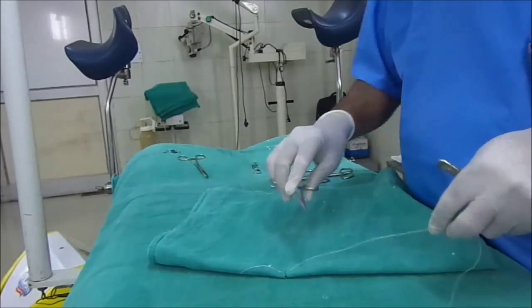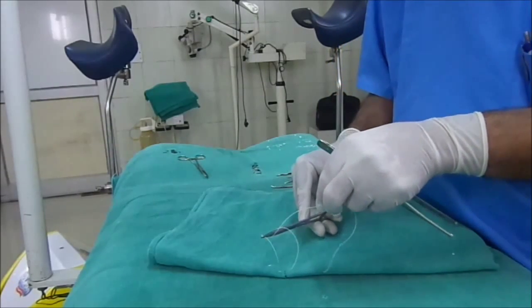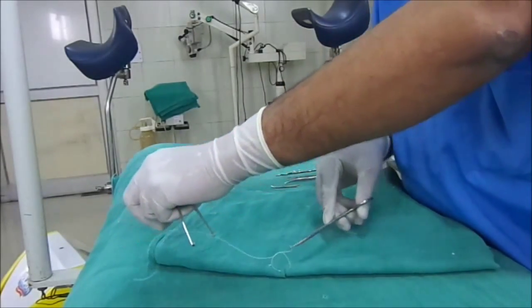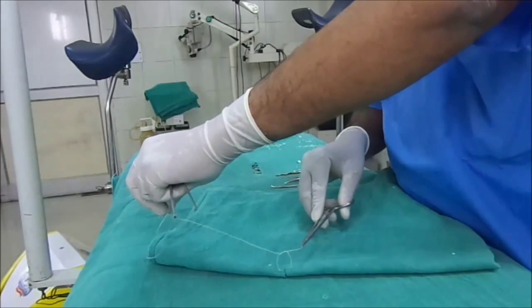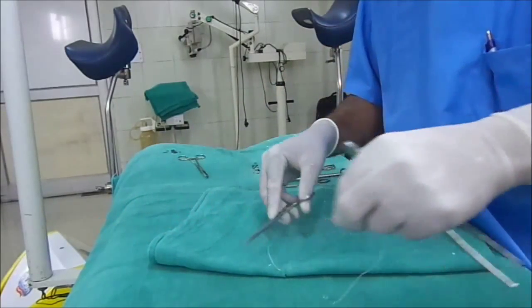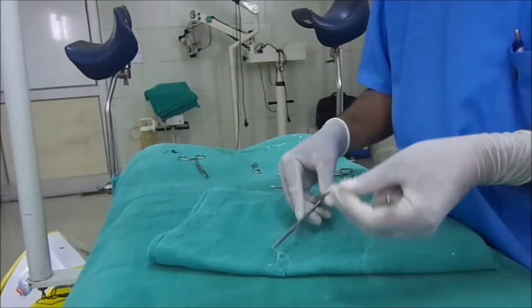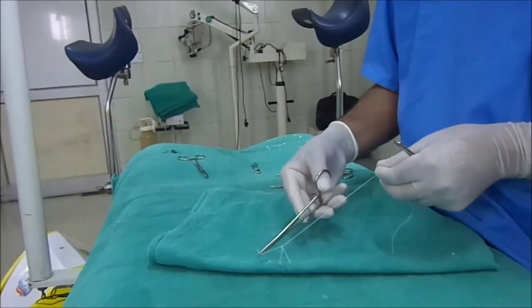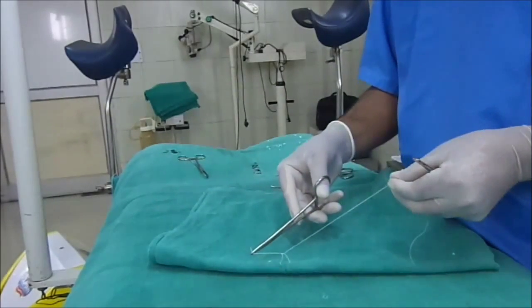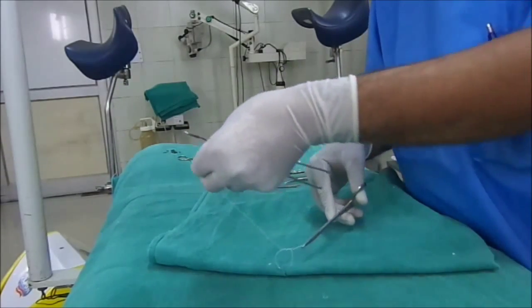Then the first knot should be tied like this. Hold the margin of the thread, and your left hand should move away from you while the needle holder moves towards you, so that the knot goes in the right direction. If you move the needle holder in the opposite direction, you can see the difference — the knot becomes distorted.